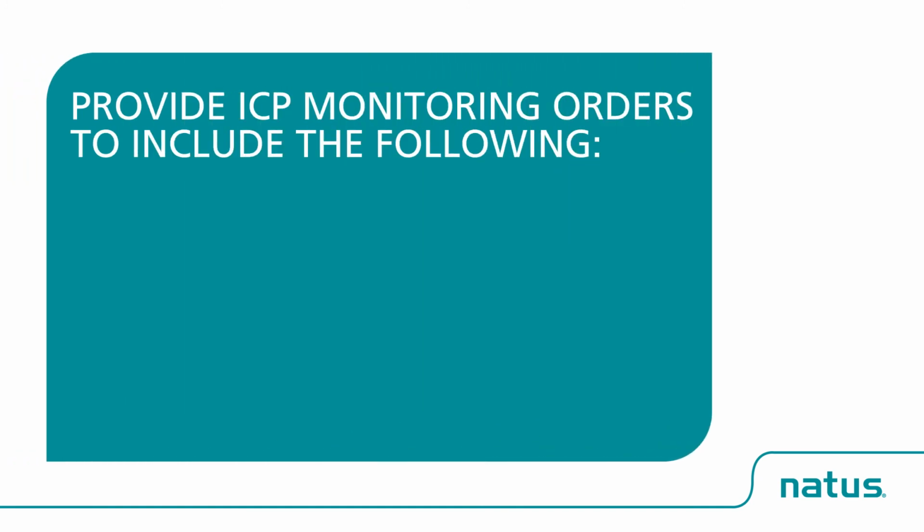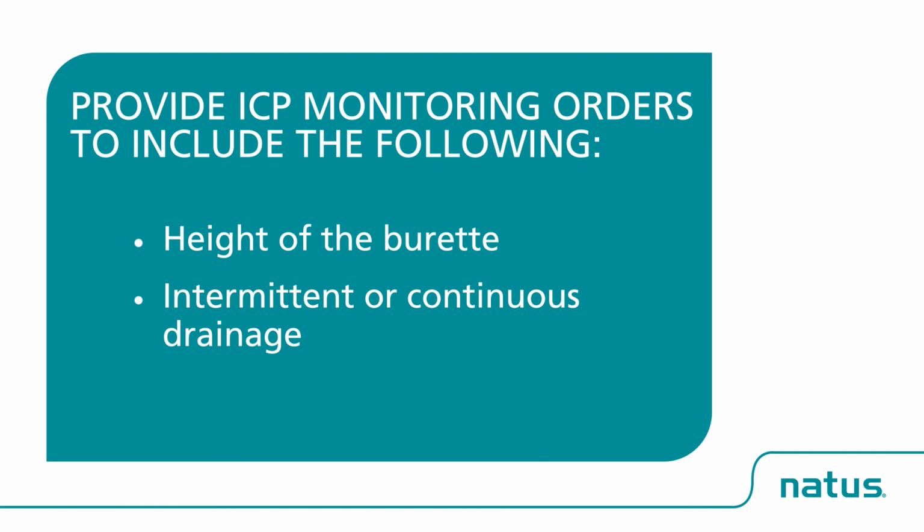Provide ICP monitoring orders to include the following: height of the burette, intermittent or continuous drainage, and dressing preferences.